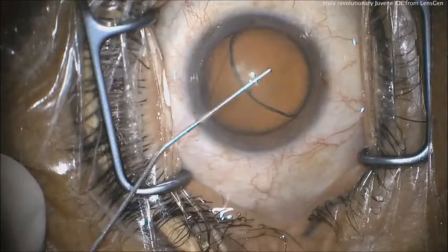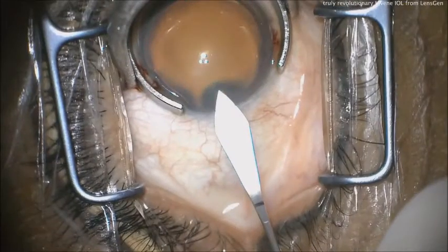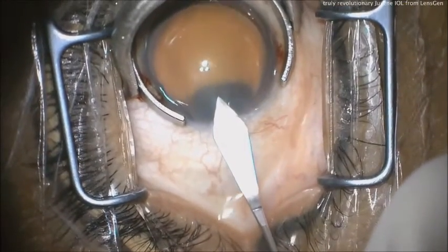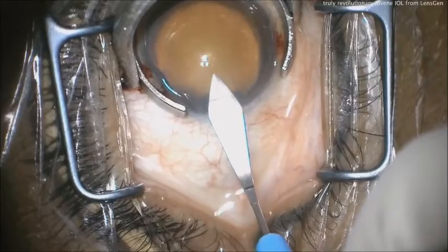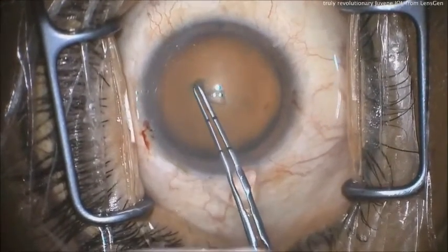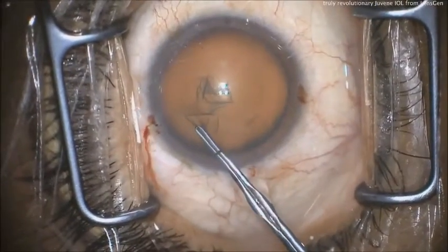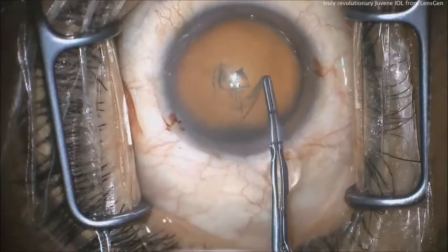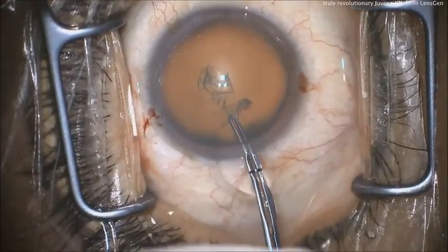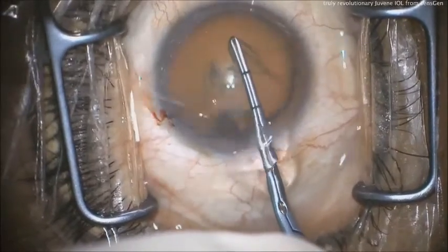Standard cataract surgery — I make two paracenteses. Normally I don't do two paracenteses, but we're doing a bimanual IA just to get all the viscoelastic out. Here's our phaco incision. We're using a slightly larger incision — I do a phaco through a 2.8, but at the end we'll enlarge to 3.0. We do our normal rhexis, about 5 millimeters, even 5.5.